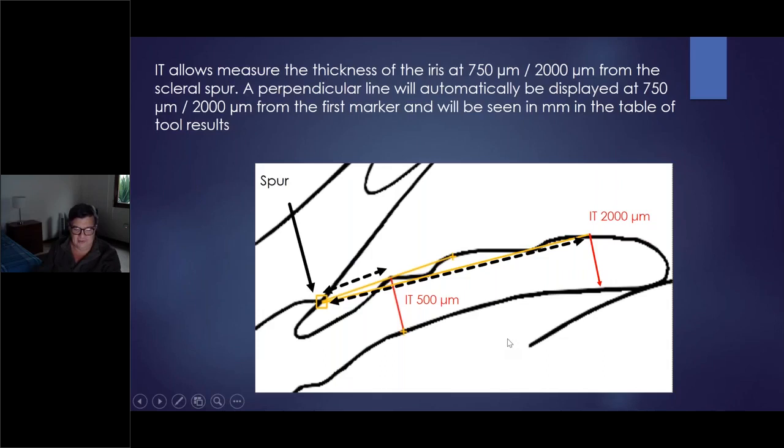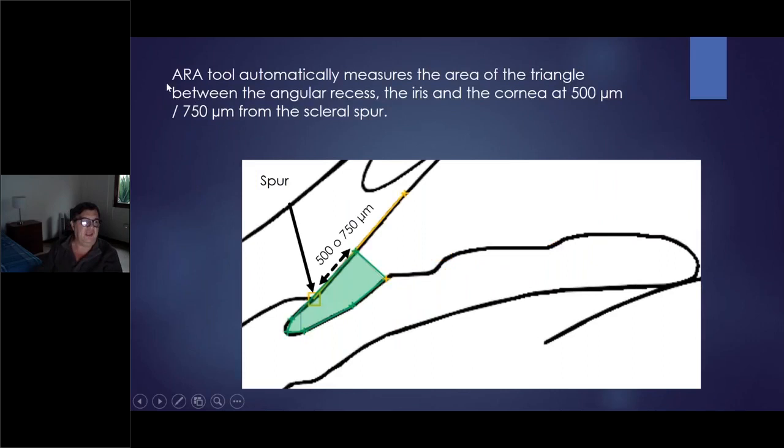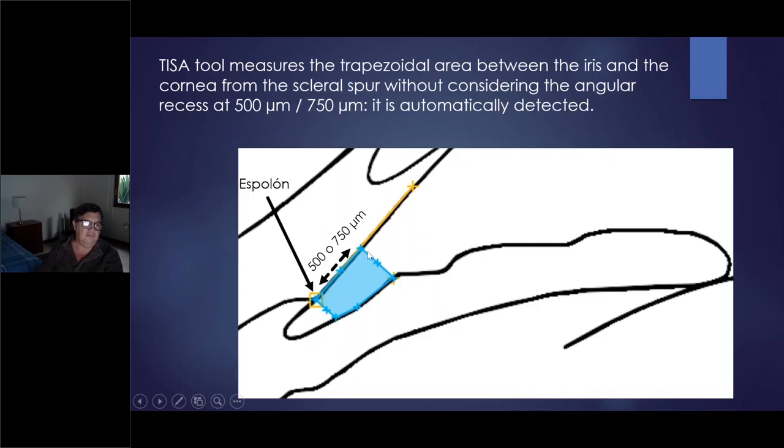You have also the angular recess area, and it measures the area of the triangle between the angular recess, the iris and the cornea. And it's very important in plateau iris. And also you can see exactly the area that is in contact just in front of the trabecular meshwork and this part of the angle. And this is the TISA. It measures the trapezoidal area between the iris and the cornea, exactly in front of this area without consideration of the angular recess.